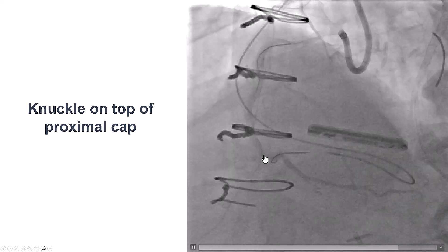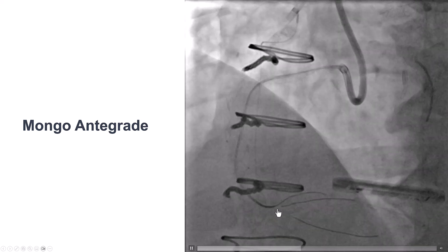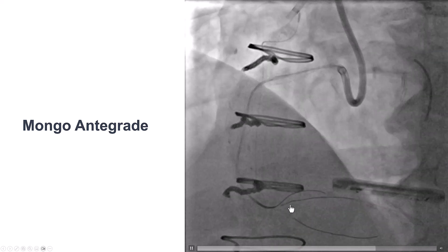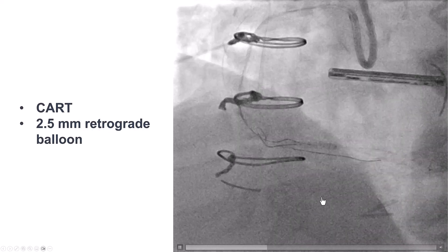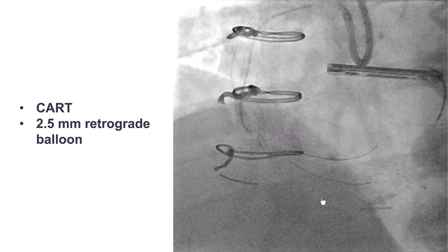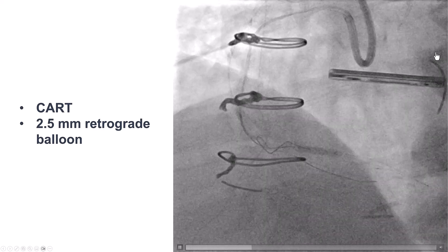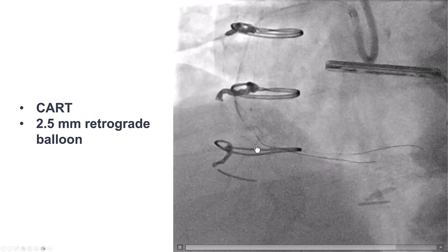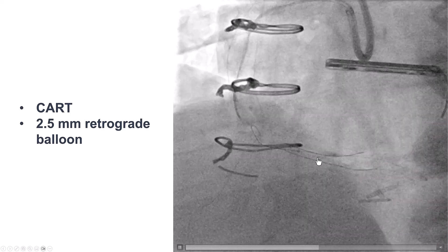So what do we do now? We have extraplaque retrograde wiring. Our thought was to try antegrade, now that we know exactly where we're going, to try to go into the location of the retrograde guidewire with an antegrade one. However, this kept entering into the extraplaque space as well. This is when the CART technique became extremely useful, because it is easy to deliver a balloon through a saphenous vein graft. If we were going retrograde through a septal, it would have been much more challenging to deliver a balloon — especially a large balloon — through that septal. But through the vein graft, we can deliver pretty much any-sized balloons.